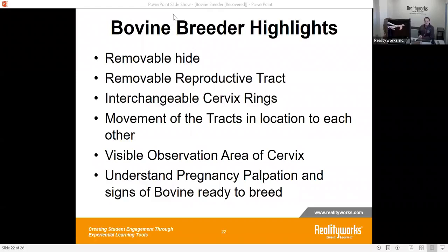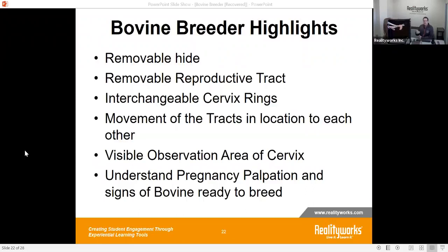The product also features movement of the tracts relative to each other using bungees. This allows you to lower or raise the cervix and reproductive tract, or move it side to side for different positions you might need. The same applies to the digestive tract, allowing a larger or tighter range of motion depending on what you want students to do. Additionally, there is a visual observation area of the cervix: inside the reproductive tract, a teacher can see whether the pipette went far enough and if the AI gun reached where it needed to be, confirming correct insemination. Students can look inside or not depending on whether the hide is covered, giving a better understanding of what's happening during artificial insemination. The pregnancy palpation feature allows you to palpate for signs of whether the bovine is ready to breed or is pregnant.